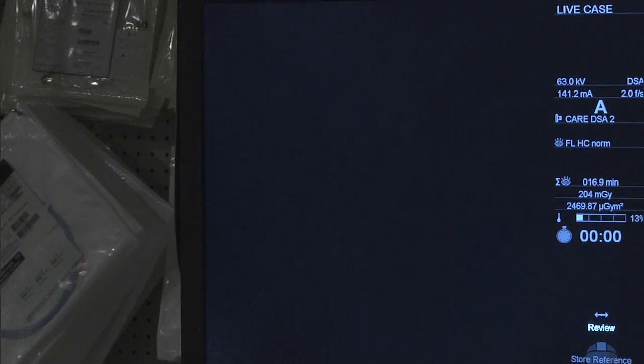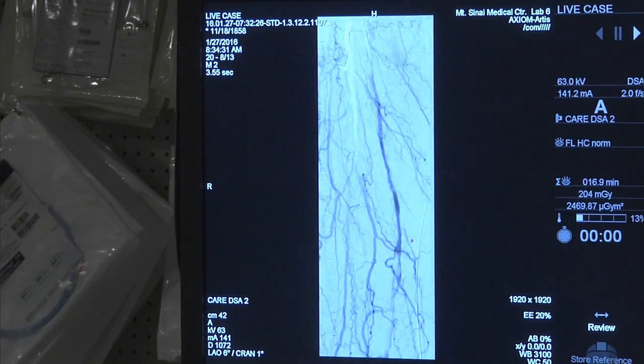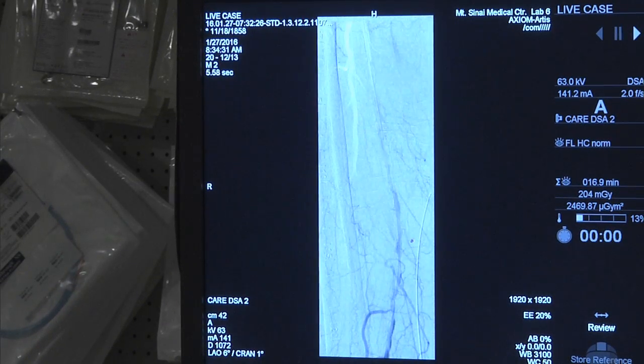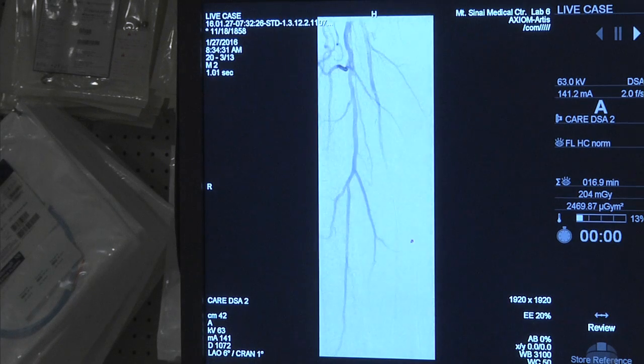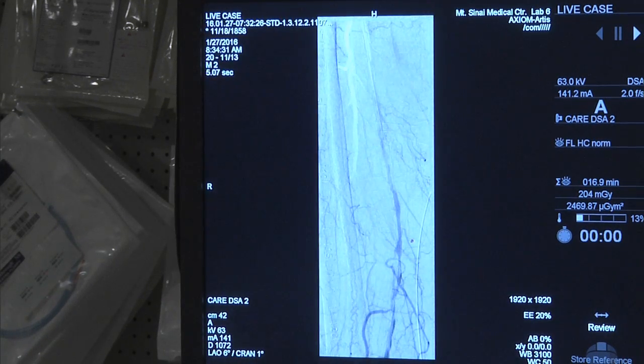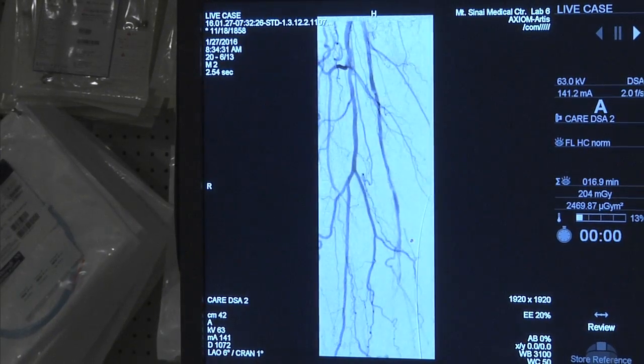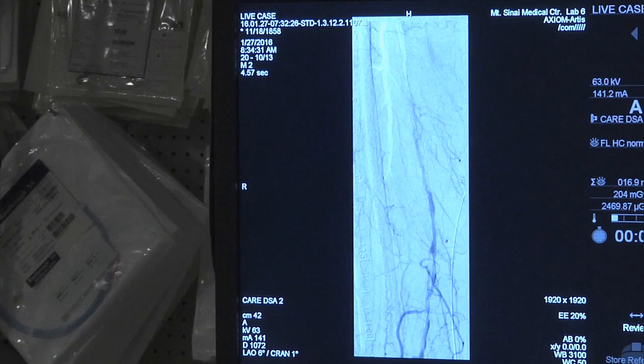Once we angiojetted up and down, I want you to look at what our result was, and now you can see you have flow in that segment that I told you about with, again, very chronic disease distally. So now you've actually uncovered the pathology that's lying inside this, and now we can come to our discussion that we've been having, right?